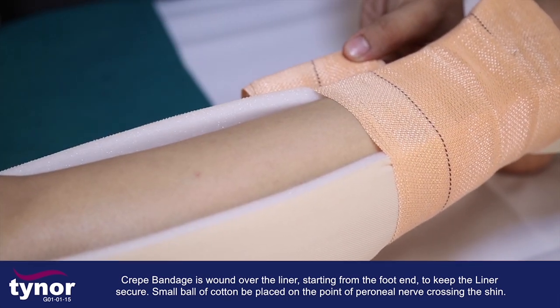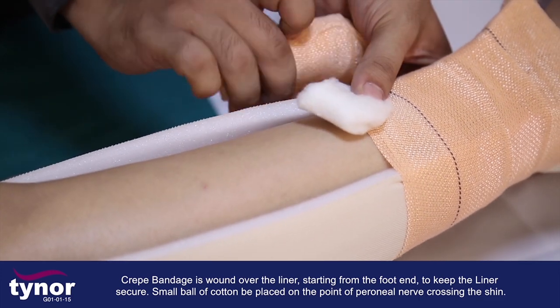A small ball of cotton is placed on the point of the peroneal nerve crossing the shin to protect it from pressure.